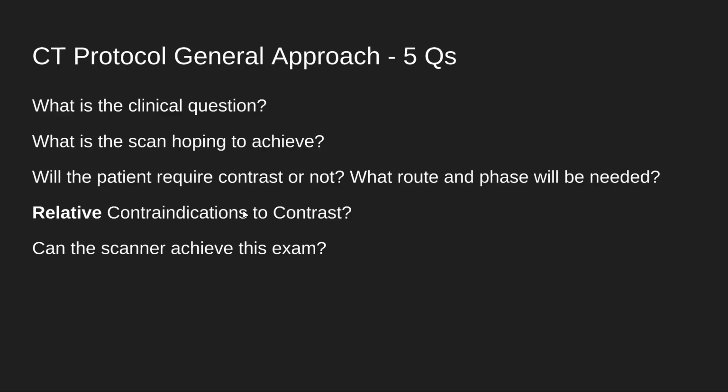When clinically indicated, it should be given without an issue. Or, for example, an allergy, and so forth. And the final question is, can the scanner achieve this exam? So, for example, in your institution, do they have something like a brain perfusion scan? Maybe you have a case where brain perfusion scan is indicated, but it's not available at your hospital. So these are all questions you can ask yourselves when protocoling for CT.